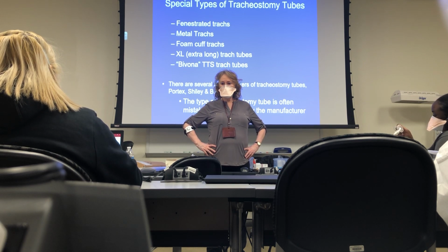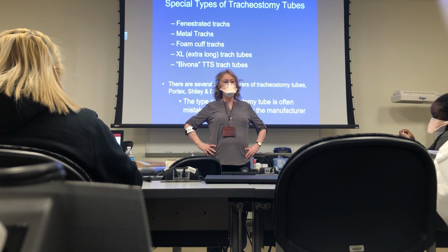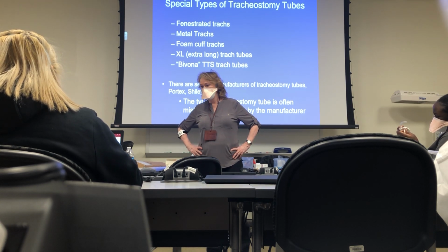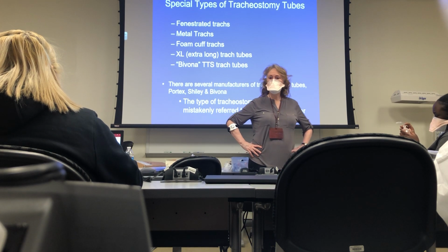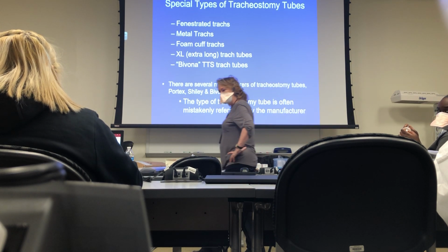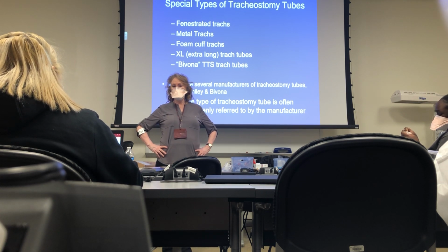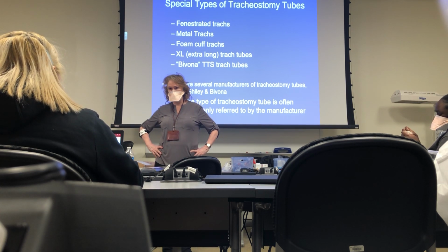Now take out your inner cannula. Is there a hole in the inner cannula? Yes and no, some yes, some no. Okay? All right. What's the purpose of a fenestrated trach?